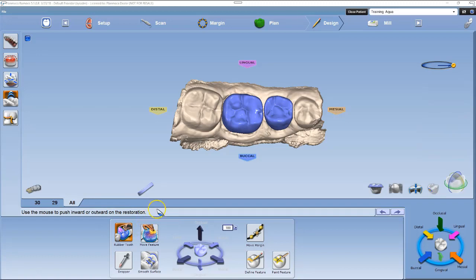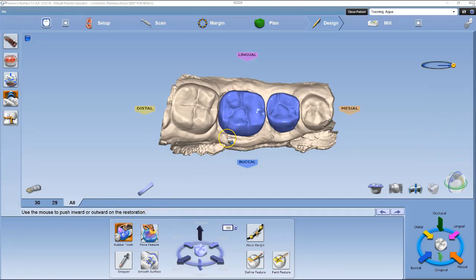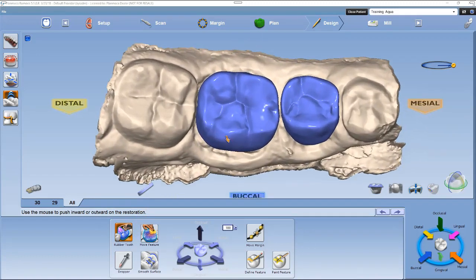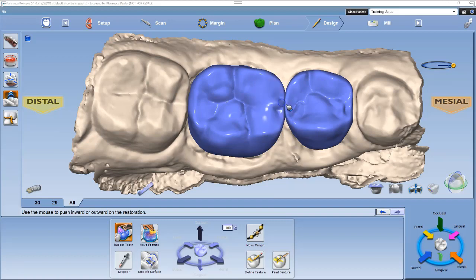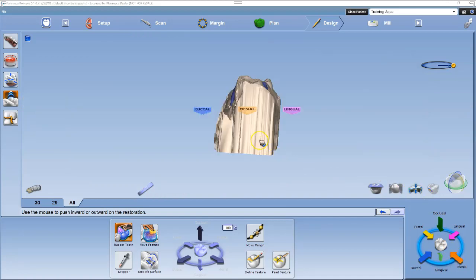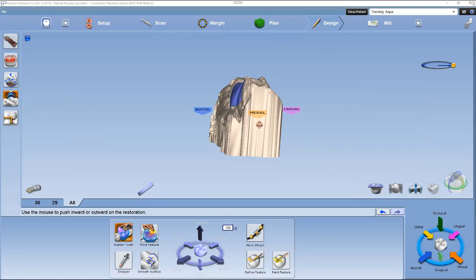The first step is staying on the occlusal view. Roll the scroll wheel towards you to enlarge the model so that you can better evaluate the embrasures. Remember, both teeth are active to adjust so that we can control the embrasures with the shared contacts better and not over-contour the restorations.